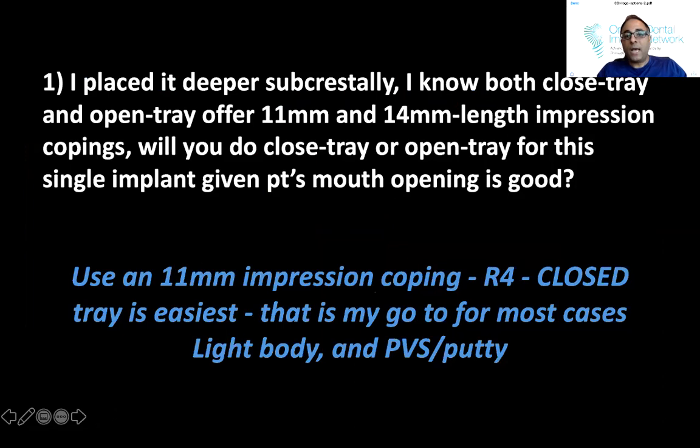Okay, and so basically an R4, which is the smallest size impression coping, is easiest. Even if you use a 6 mm wide healing abutment, it just allows you to seat it very easily. And then I use my light body and my PVS or putty to pick that up.